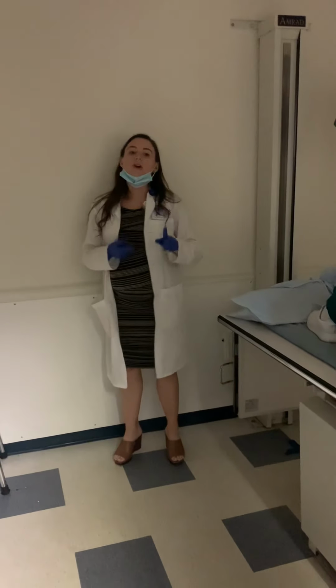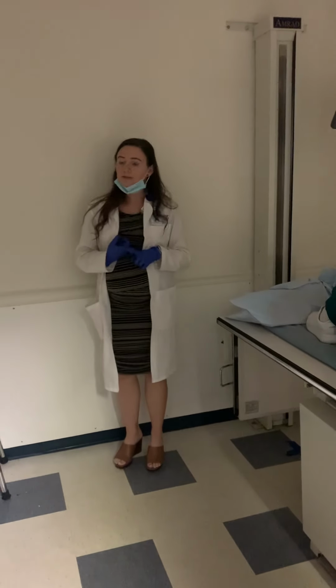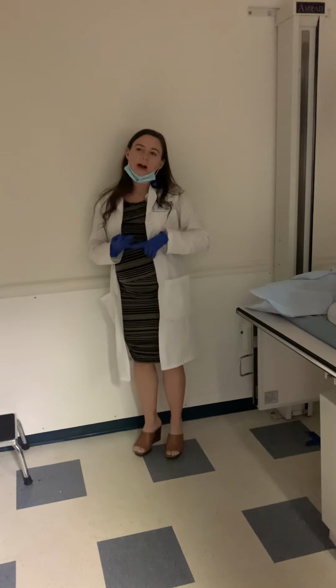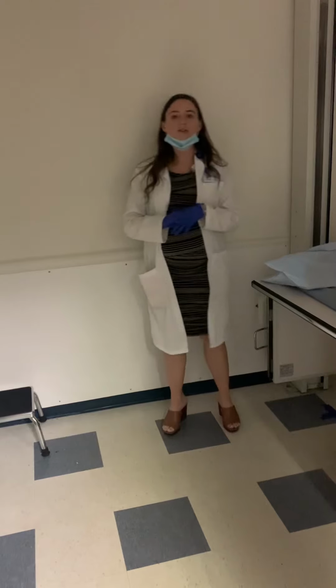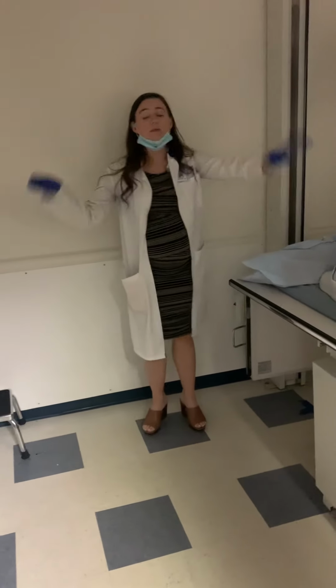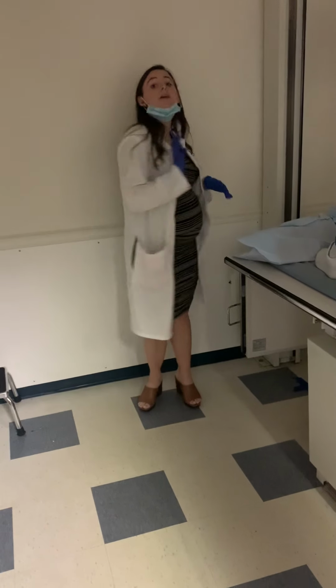This patient would have already been asked history as of when's the last time you've eaten or drank anything, did you do your prep, and then we're gonna have them drink either barium or gastrografin or some kind of water-soluble contrast depending on the actual patient. So they have already drank this, we've already checked to make sure she's NPO, we already asked her if she had any surgery, the doctor came in, we brought the fluoro tower over, he moved her wherever he wanted her to be, we looked at her under live x-ray, and he leaves.